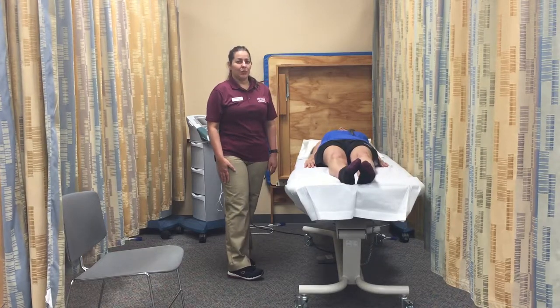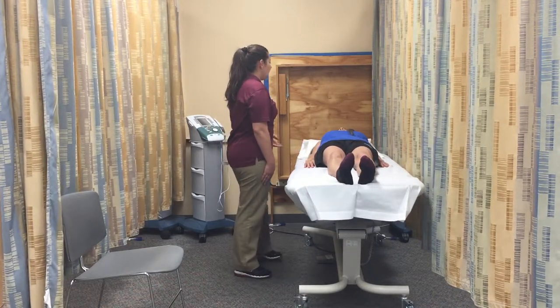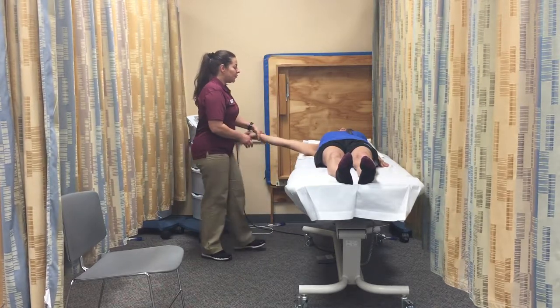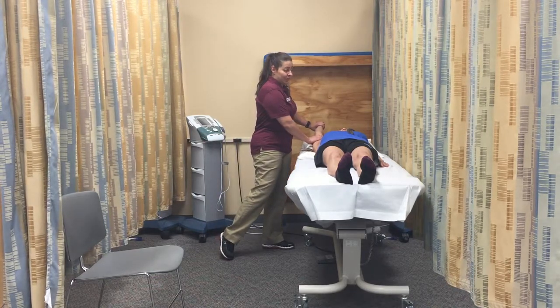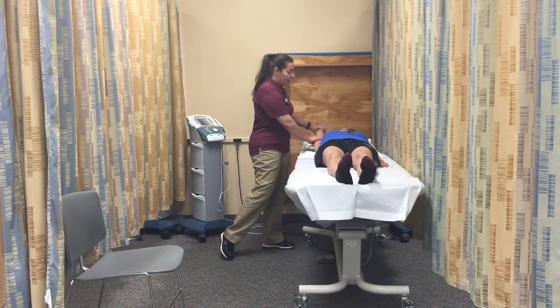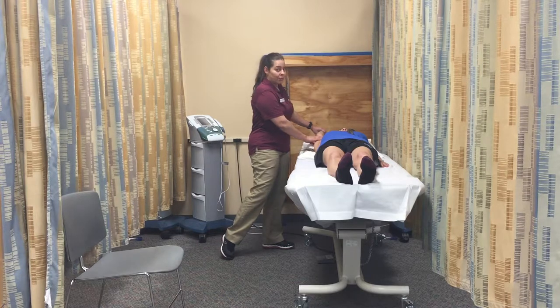First I'm going to place my patient in the testing position. Then I'm going to move the patient through the available range of motion, determine the end feel, which is firm, and make a visual estimate of the range of motion, which is 180 degrees.